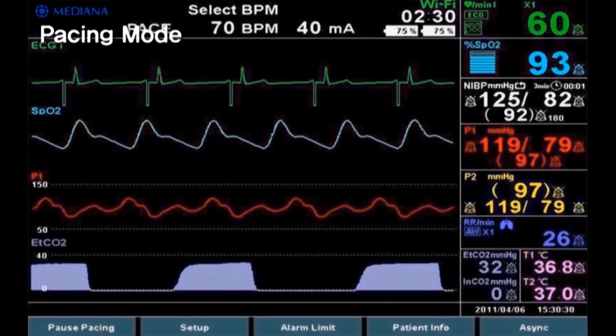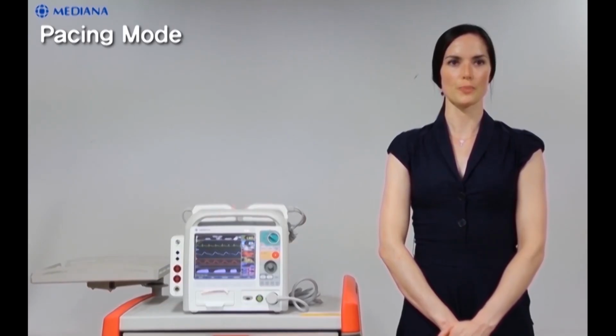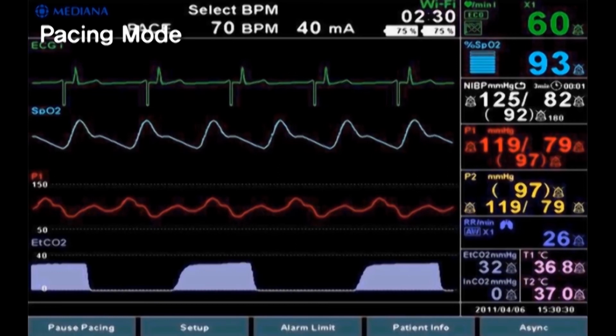If you want to activate async mode, press the async soft key located in the lower right corner of the screen. And if you want to pause the pacing, press the pause pacing soft key located in lower left corner of the screen. To resume pacing, press the pause pacing soft key again.